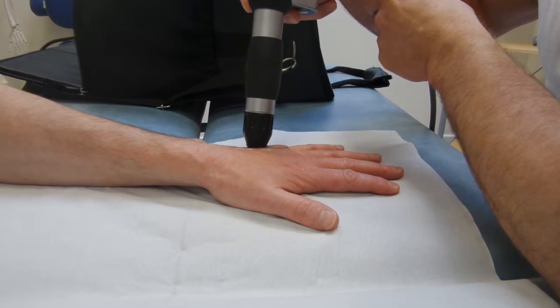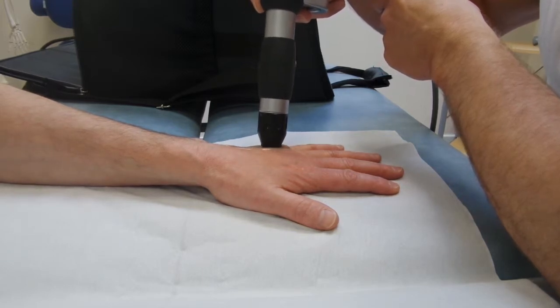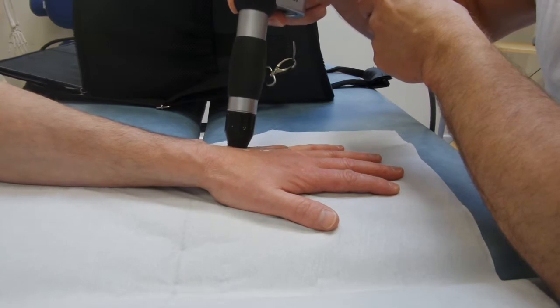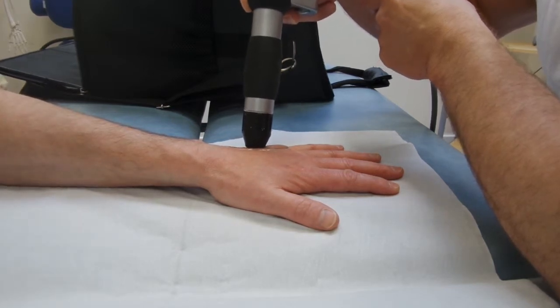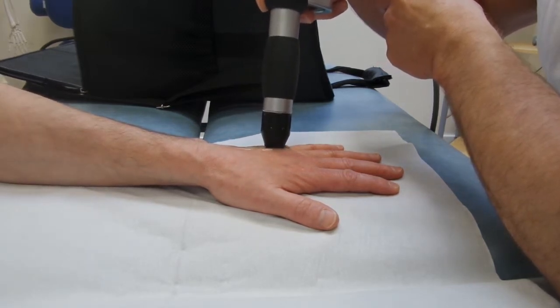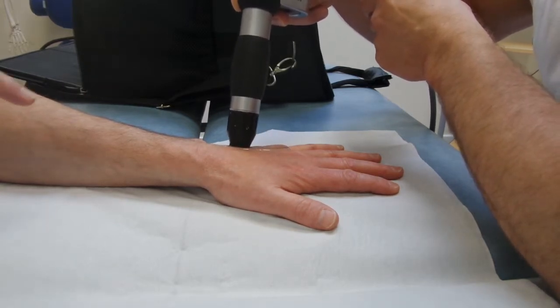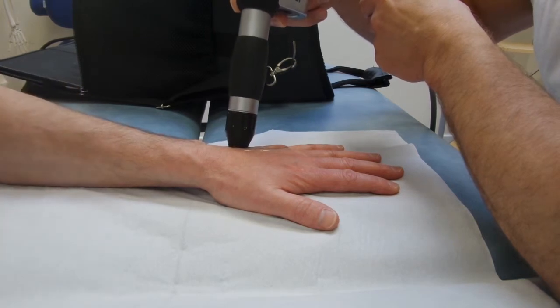In this case the trigger points are towards the end of the gutter and down at the bottom of the gutter towards the end of the metacarpals. The bit in between seems to have cleared now. This is the third treatment. The other two treatments were done with the NF-811.